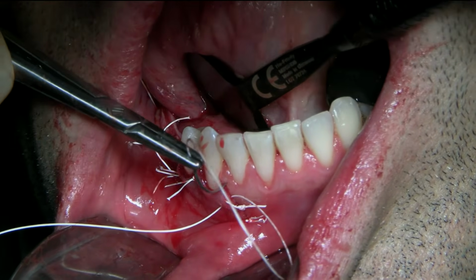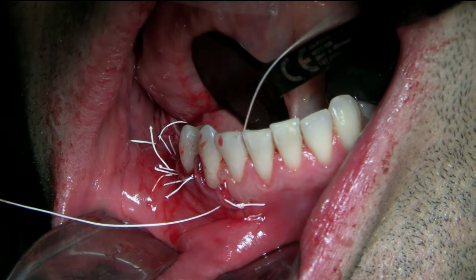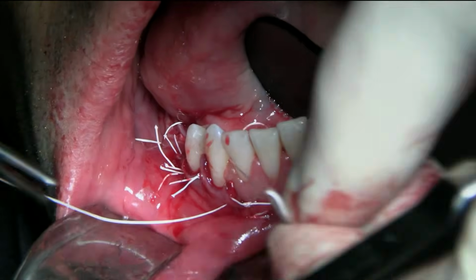Mohammed, we're slowly but surely getting to the end. You're doing great, man. We'll give you some anesthetic at the end, so you go home with some really good numbing.